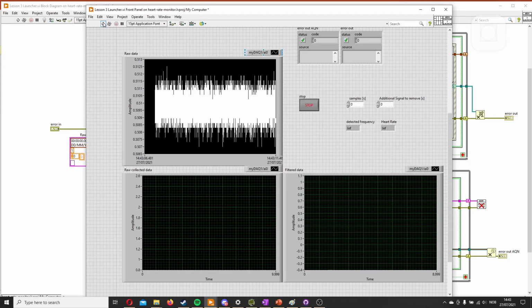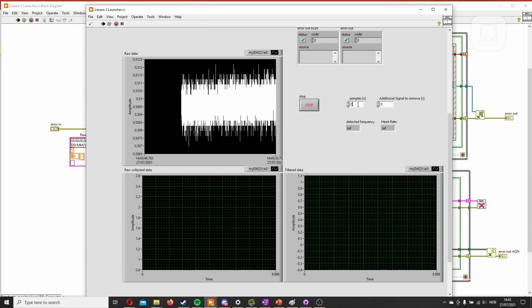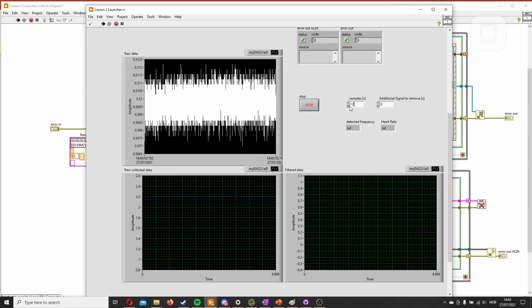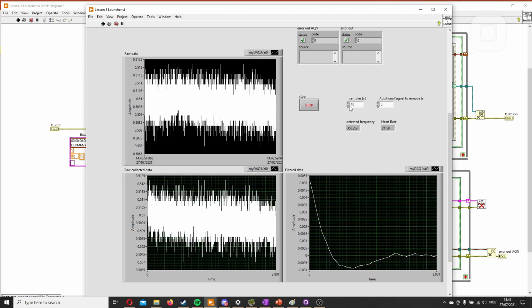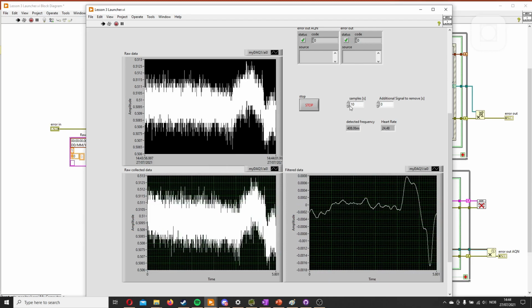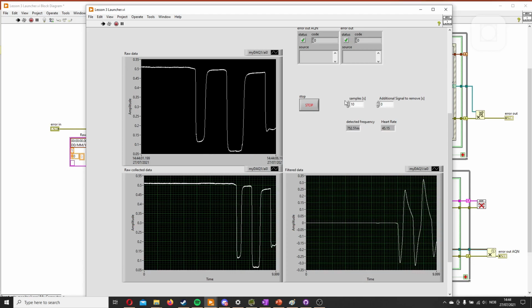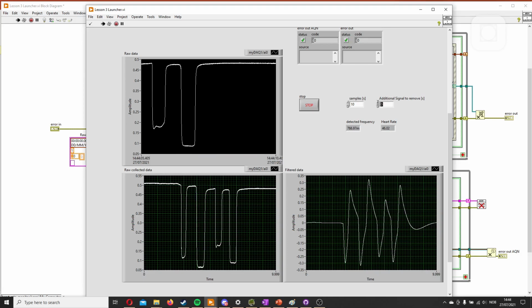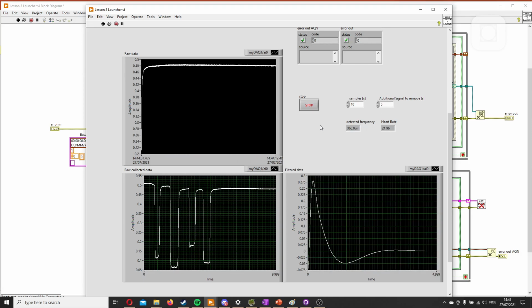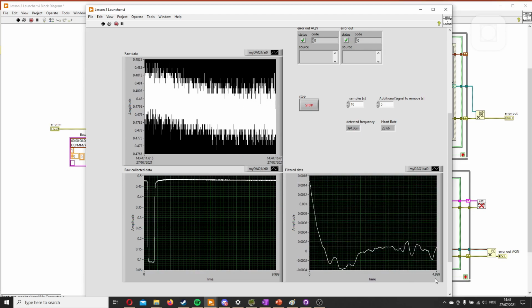Control E, press play. We get nothing here because we haven't selected the amount of samples. Let's say 10. And here we get something. I won't hook up to read the pulse because it's the same one as last time, but what I will do is I'm tapping the input and we see it works exactly like the last time. And we can test this one too. Remove 5 seconds. And we see 10 minus 5 is 5 seconds. So this works too.